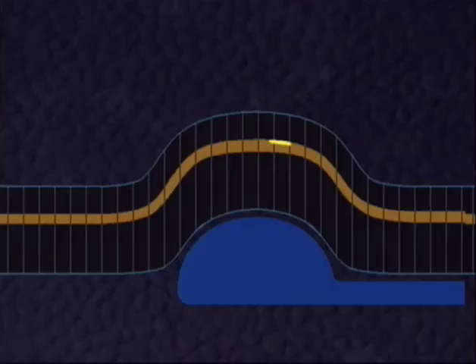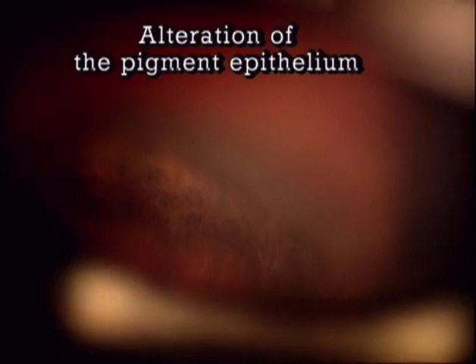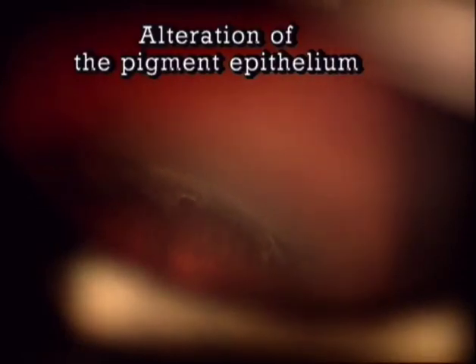In contrast, an alteration of the pigment epithelium is invisible at the summit of the protuberance. Therefore, the scleral indenter is shifted until the area in question is at the front of the protuberance, where the retina will appear almost transparent. Therefore, alterations of the pigment epithelium can be observed in detail at the front, but the same alterations become invisible on top of the protuberance because they are hidden there by the opaque retina. Note, now a previously invisible retinal hole can be recognized.